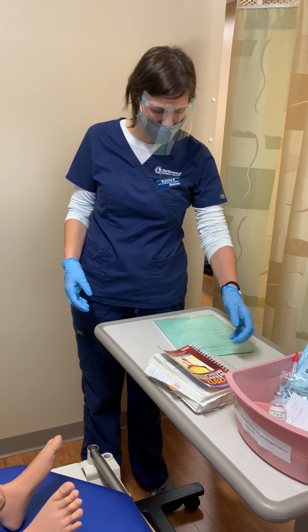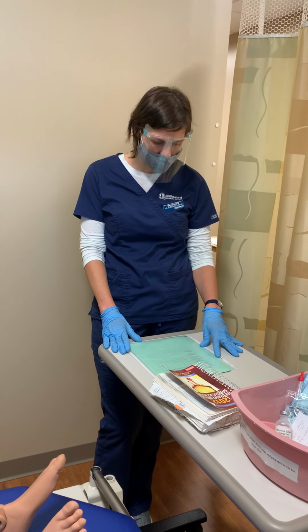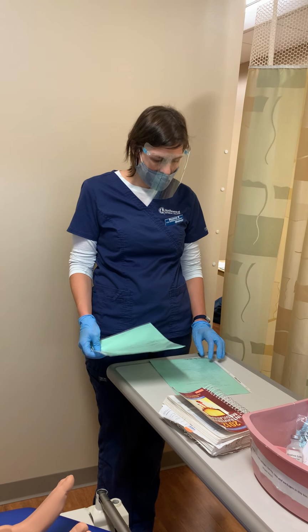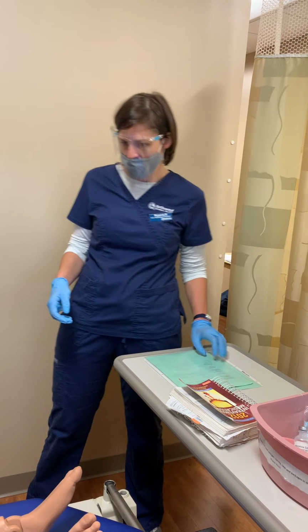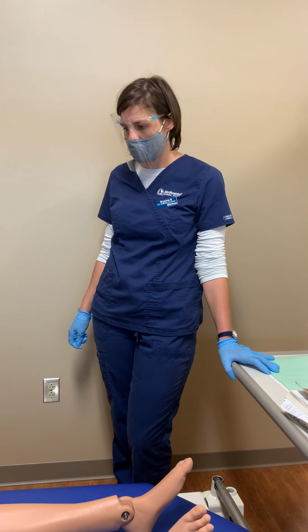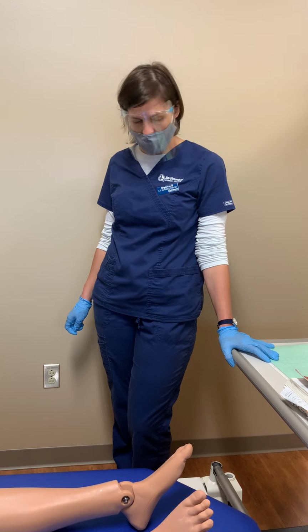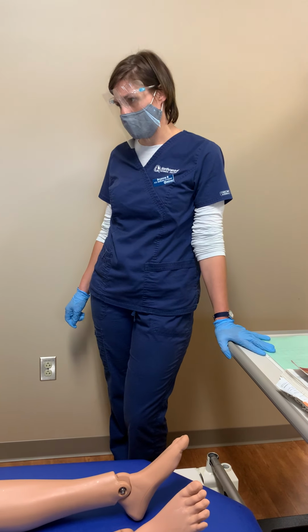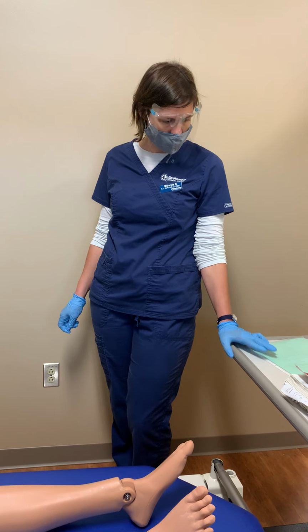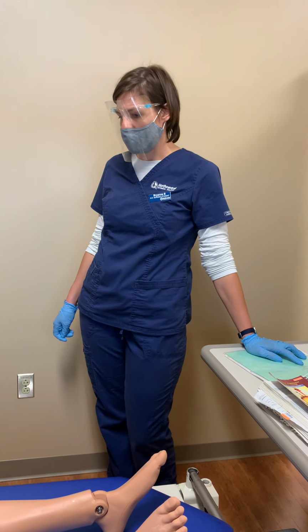While I'm looking at my order, I'm checking my allergies. I see that she's allergic to Betadine and codeine, which is not going to be an issue for these medications that I'm giving. Now, Francis, I'm here to get you going on some potassium chloride that the doctor ordered. We're going to run that through your PICC. I also heard that you're in quite a bit of pain right now, so I see from your charts that the morphine works pretty well for you. We're going to give you a dose of that. It's been long enough since your previous dose, so we can give you another 2 milligrams of morphine.